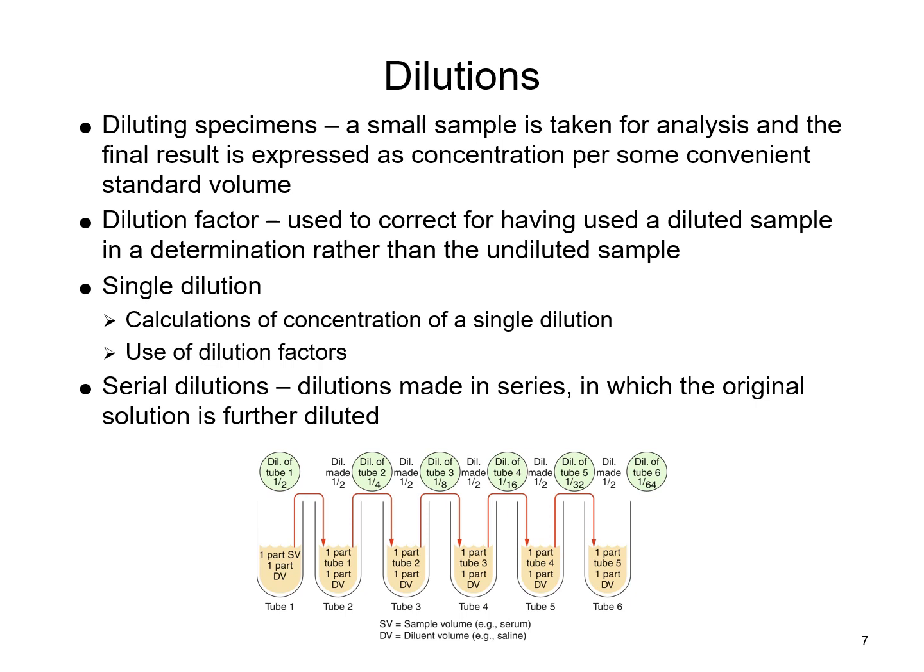This is why we spent so much time on this when we discussed it in intro and lab math. We were building you up to this point, to start recognizing when you make these dilutions why they're relevant and how to do the math.